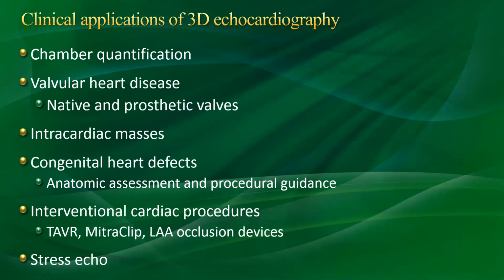As you all know, the interventional structural heart disease field has evolved in the last 10 years, and 3D echo is a very integral component in that regard. For TAVR, we all know that CT has won this battle, but in some cases we still use 3D echocardiography. Mitraclip and left atrial appendage occlusion devices, we rely heavily on the use of 3D echocardiography.